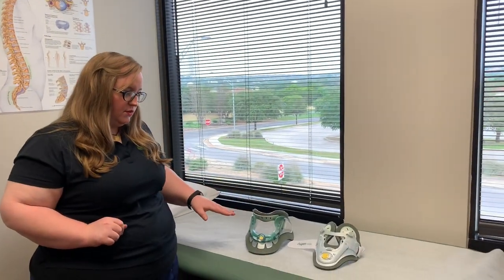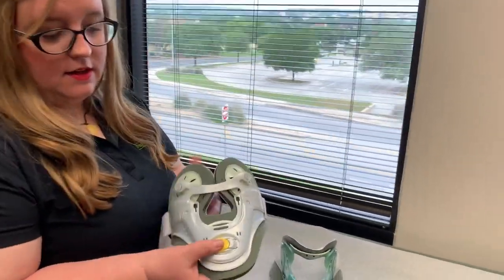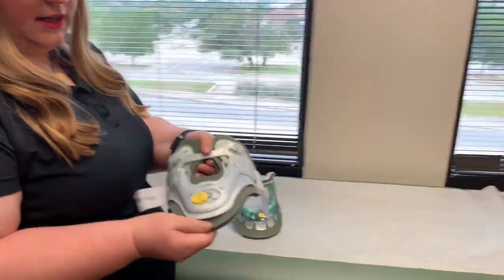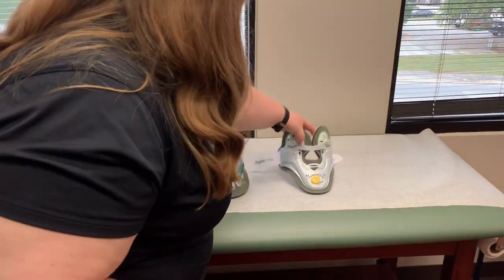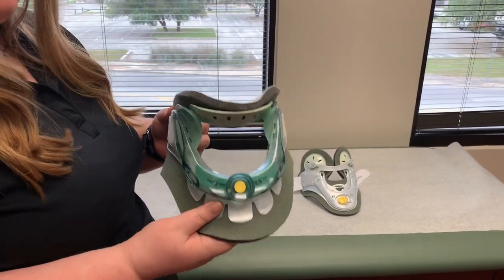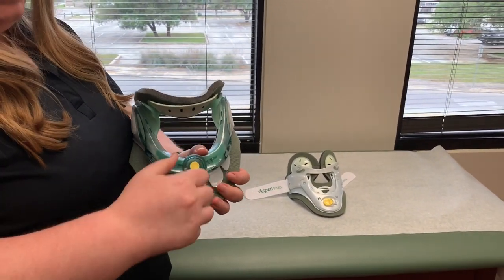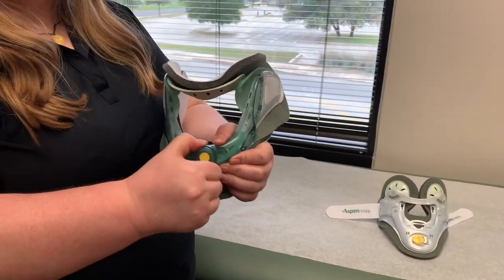This is what your cervical collar will look like disassembled. This is the back piece — it'll go on the back of your neck. It can be adjusted depending on how long your neck is; it will slide up and down just like that. This is the front part that will be worn under your chin. It's also adjustable depending on how long your neck is and how much support you need at the time. It can be adjusted by pulling out this knob and turning clockwise or counterclockwise.